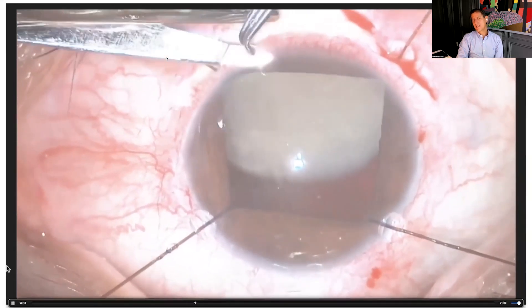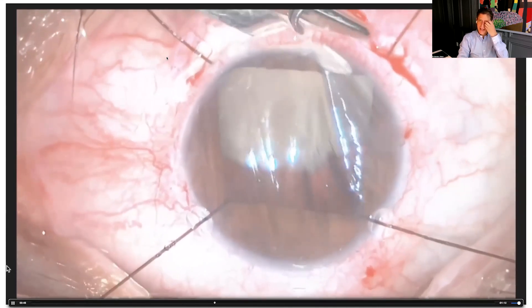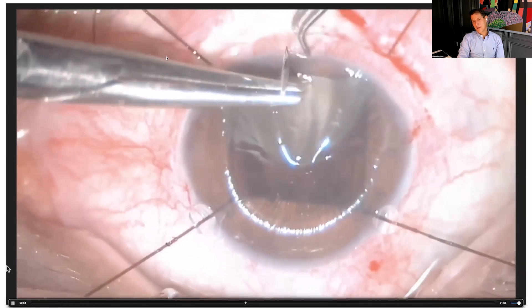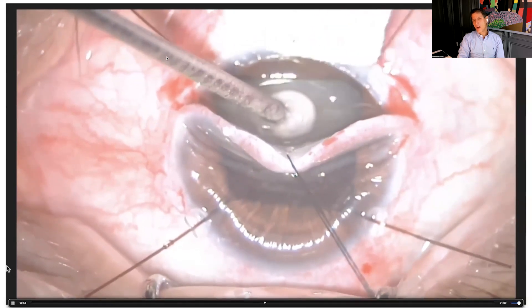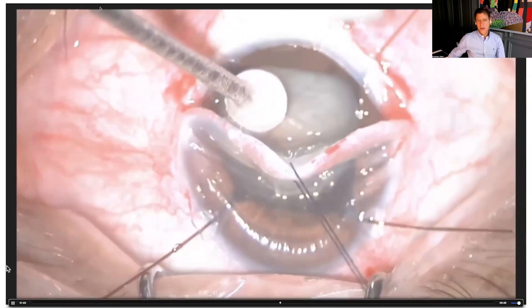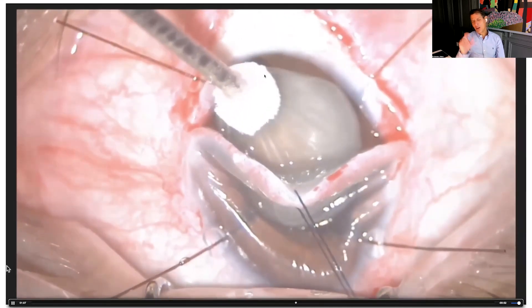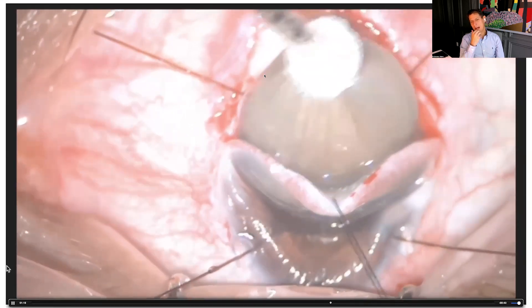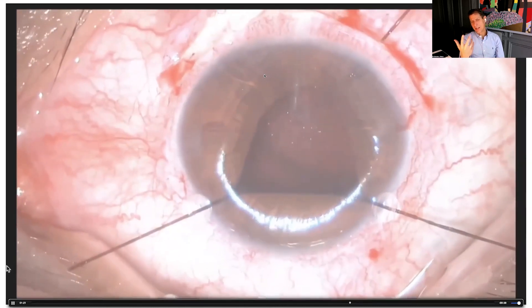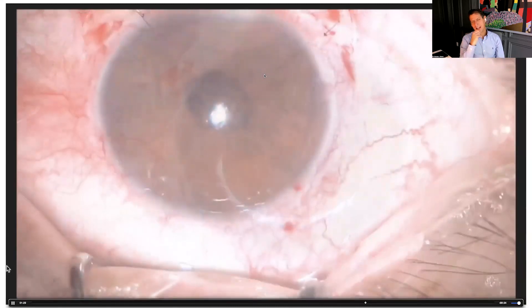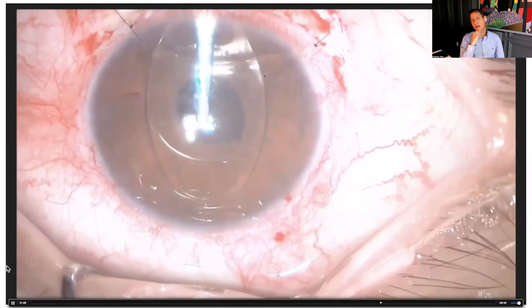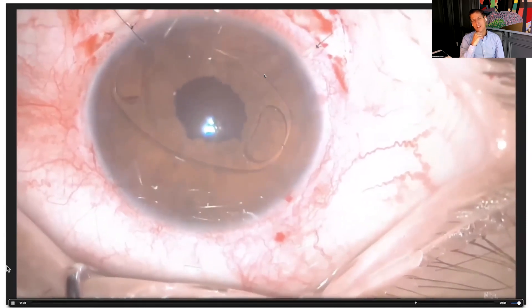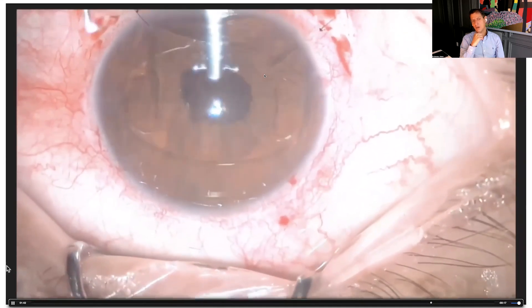The lens is very dense, so bringing it forward is difficult. For young surgeons who haven't seen this: you take the cryo probe, hold on the capsule, and do a gentle sideways movement until the crystalline lens comes out. It's important to use a fixating suture so the cornea doesn't contact the cryo probe. Then I go in and fixate an Artisan aphakia lens — a great option for this patient.